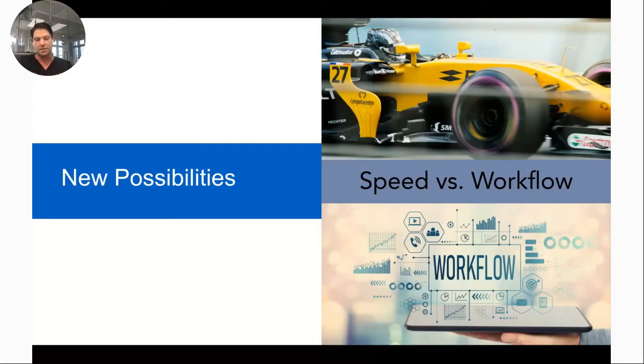And then from a standard workflow procedure, most of the time, what I'm delivering for the patient is printed at least a couple days in advance. And then my normal process is I hit print on the printer in the morning. And then with the standard gray resin, anywhere from 2 to 3 hours later, it would be finished printing.